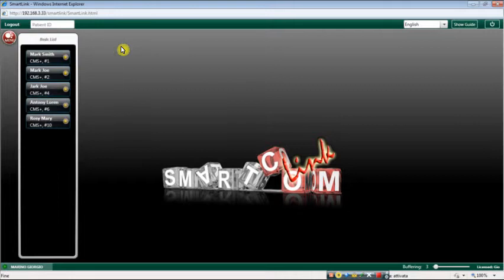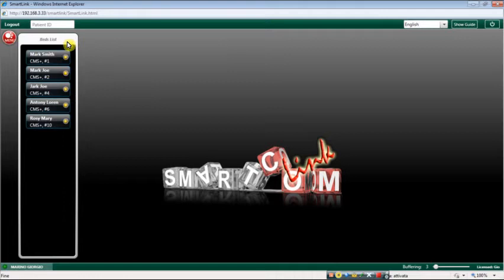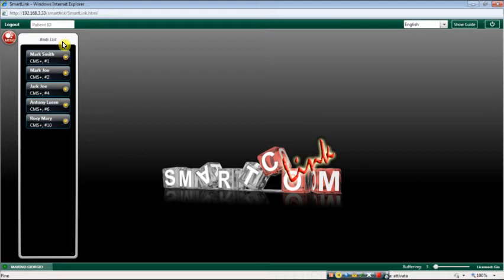This section is dedicated to SmartWaves. The Beds list shows the currently active beds. An active bed is a bed for which the system receives data from the patient's monitor.